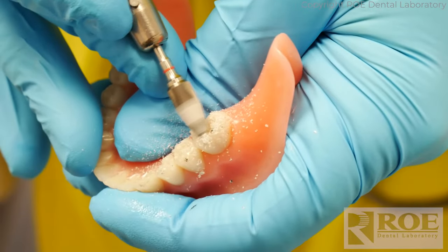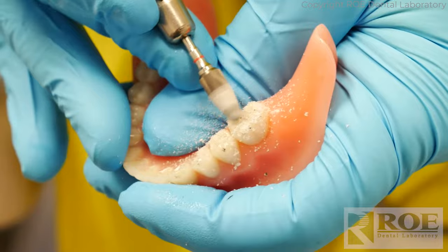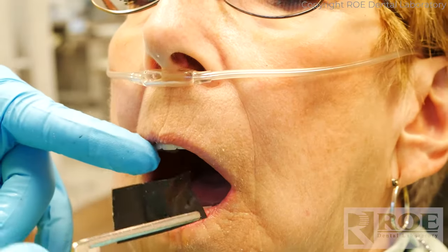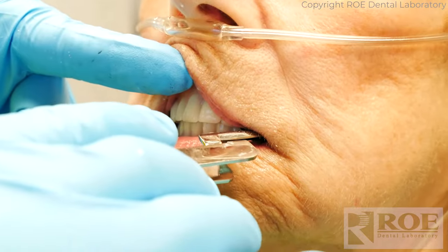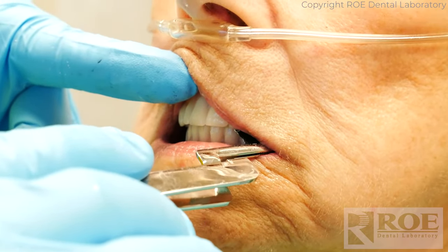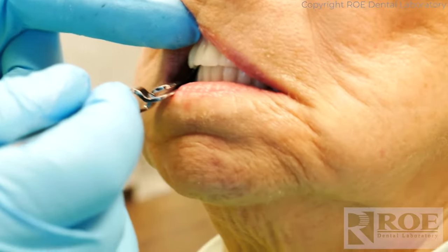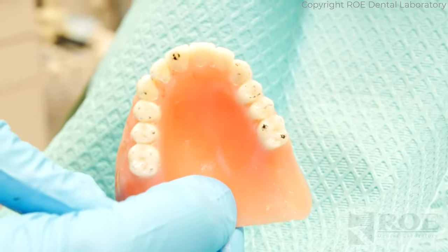A little more aggressive because the lingual cusp is not the active cusp in this case — maxillary lingual right, and then mandibular buccal. Bite down again, grind forward and backward. I love it when the patient knows exactly what to do. Now you can let go and bite down again and go forward and backward. I love it, thank you. This is the one that's touching heavily.